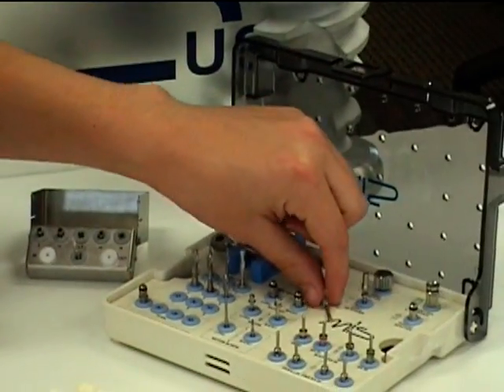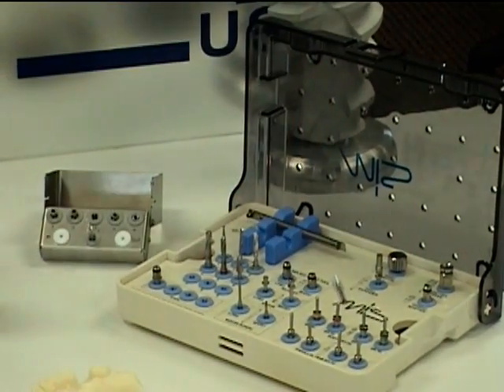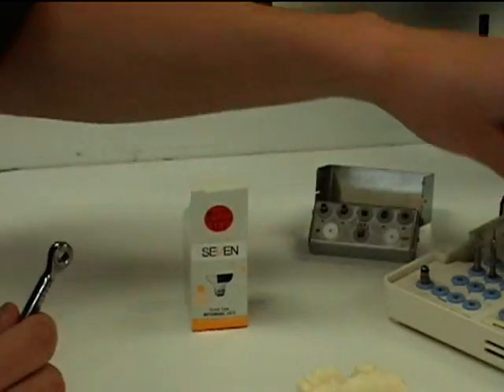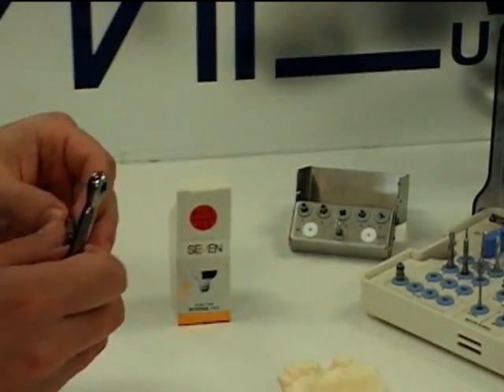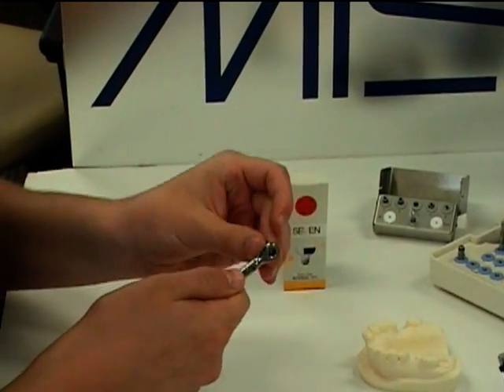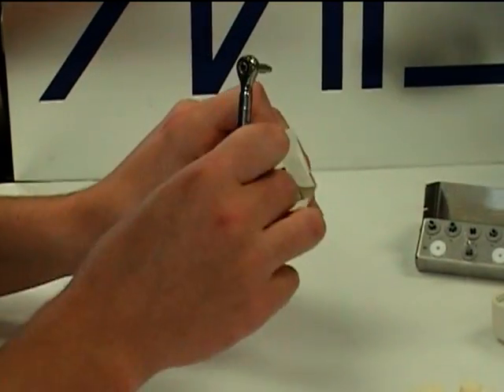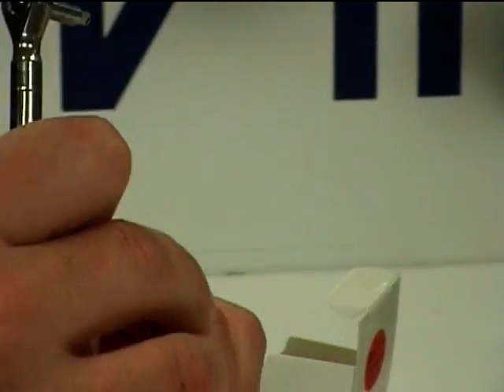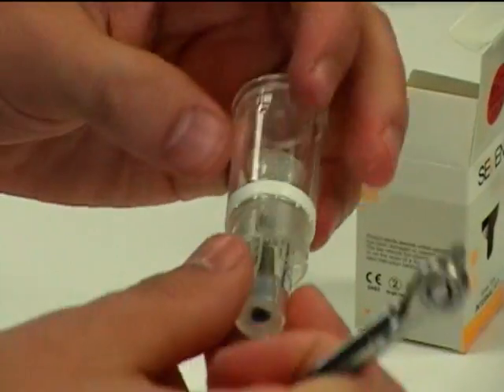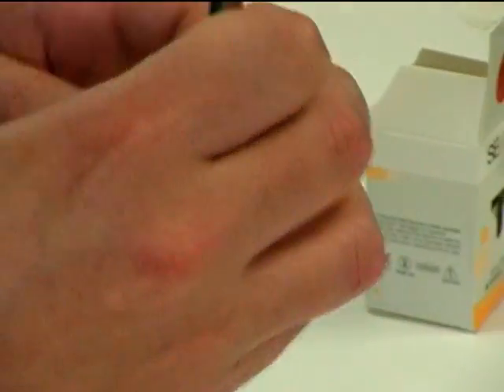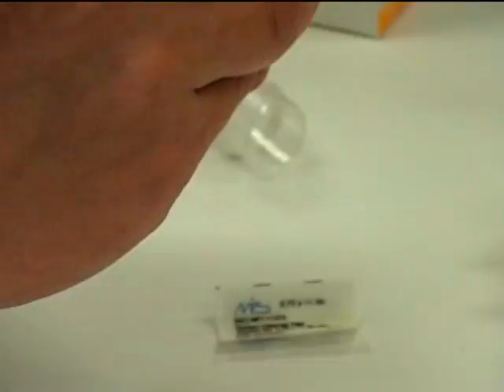I'll be placing the implant using a ratchet wrench and a long adapter. The 7 implant comes attached with a fixture mount.